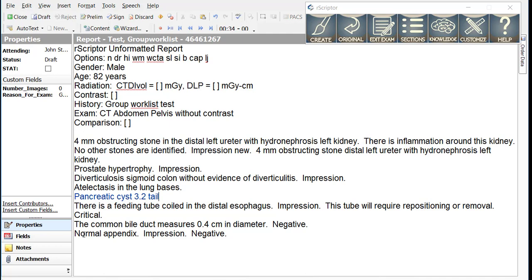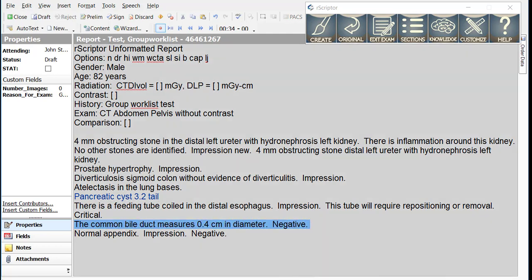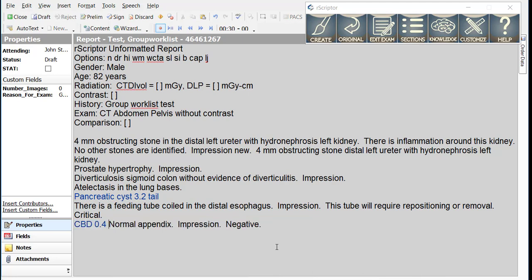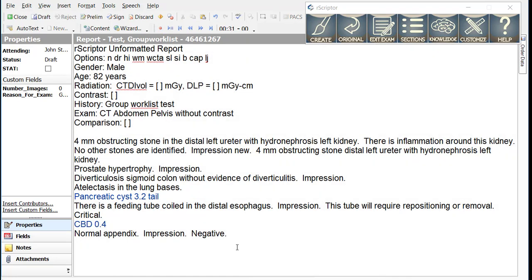Similarly, for the common bile duct, we can simply dictate CBD 0.4. Next line. With those two smart macros dictated, we can now create the report.